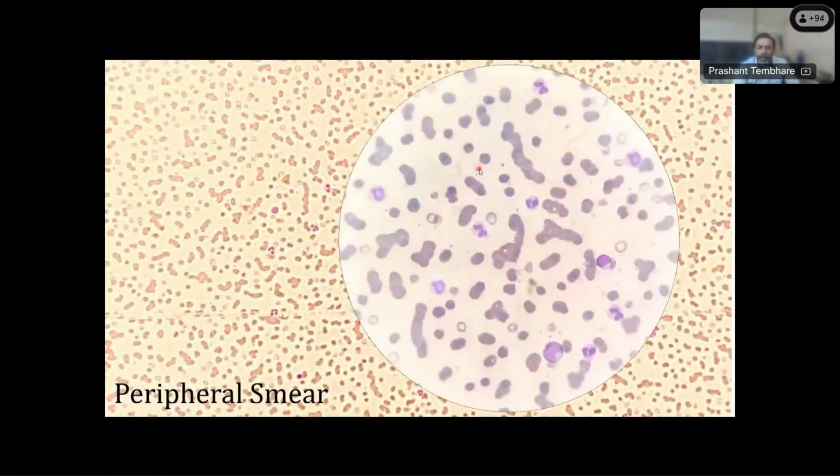And this is a closer view. There is a nice rouleaux formation. And the count is slightly high. You can see it was 13,000, with neutrophils at 70 to 80%.